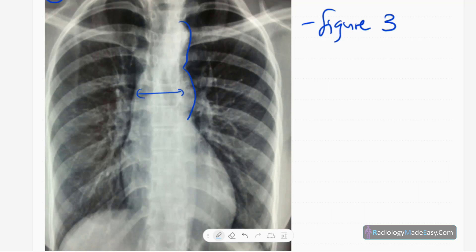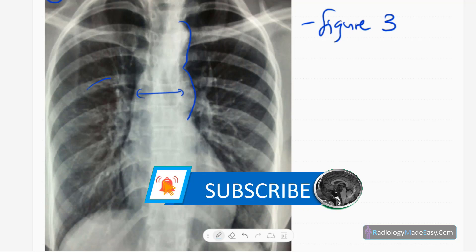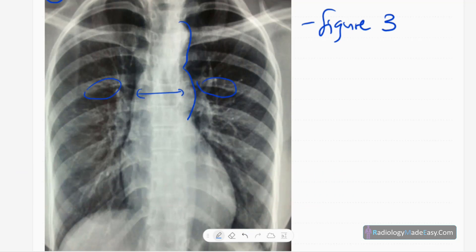You can also see some subtle rib notching — some erosion in the inferior aspect of the ribs. Inferior rib notching is present. Otherwise, lung parenchyma is normal, pulmonary vasculature is normal, no cardiomegaly, trachea is central but slightly to the right side, and diaphragm contour is normal.